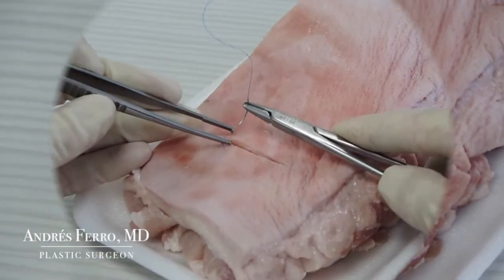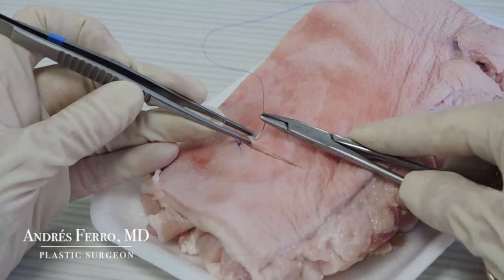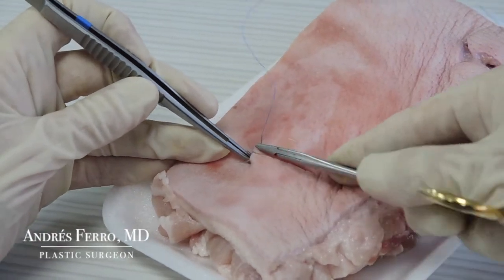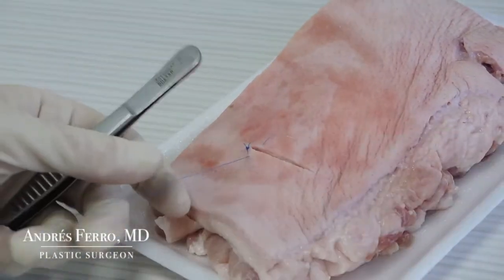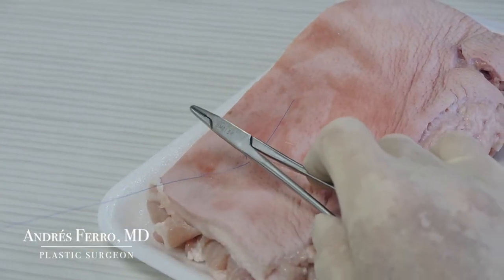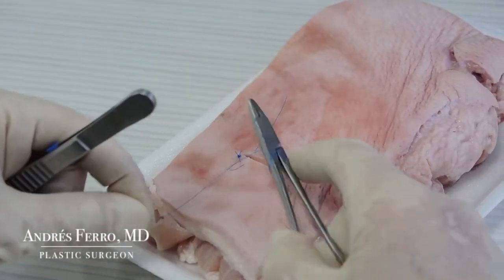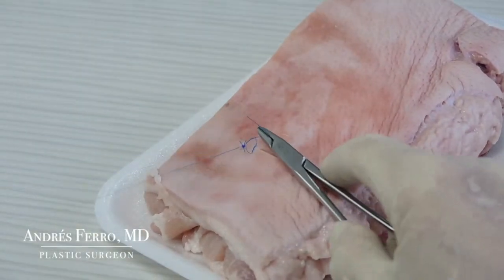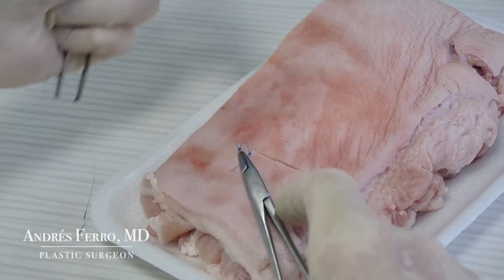Now we will make the second stitch, passing it in a single step, without removing the needle through the center. Pass the 2 lips of the wound and make the suture the same way as before. Begin the knot by making 2 loops forward, then 1 backwards, and so on to complete 5 knots per stitch.